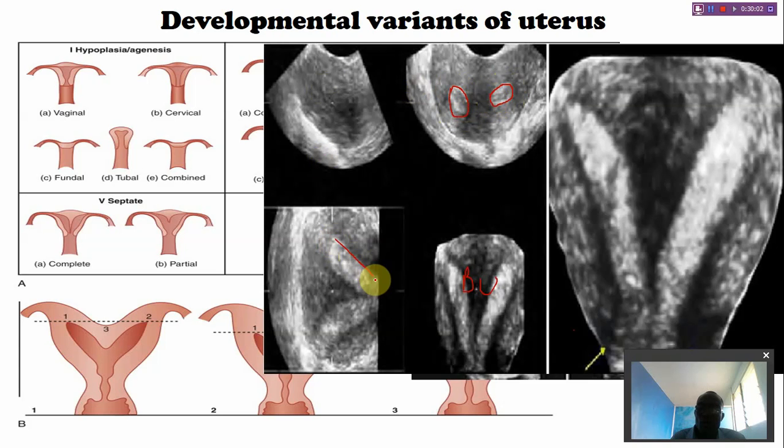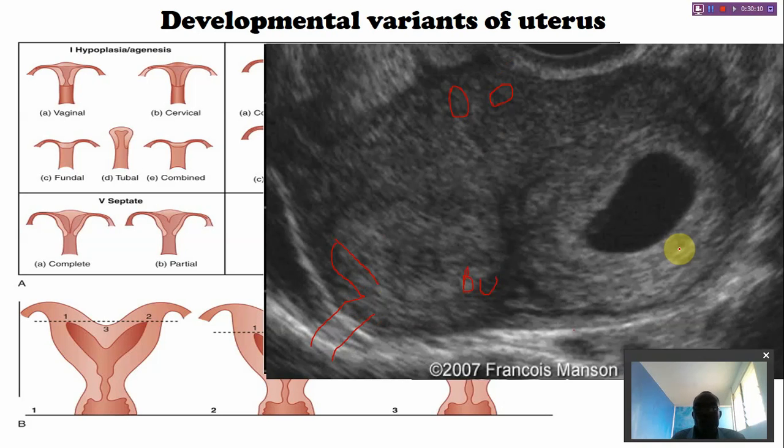We can also see another one here showing the variants. So these are other ones. You can see this uterus has 2 endometriums. There's no pregnancy in this one, but there's a pregnancy in this one, showing a normal gestational sac with normal decidual reaction, no subchorionic hematoma or hemorrhage, and you can see a normal decidua parietalis running around the endometrium.